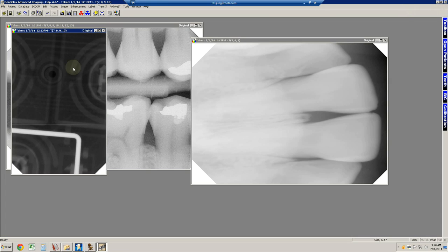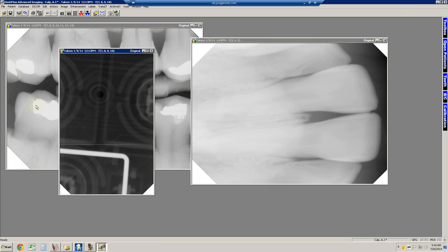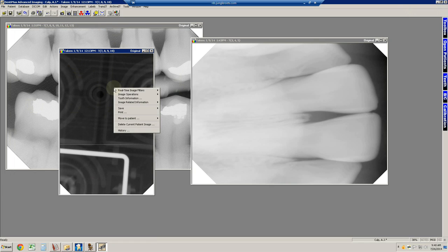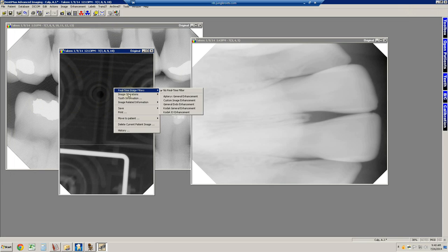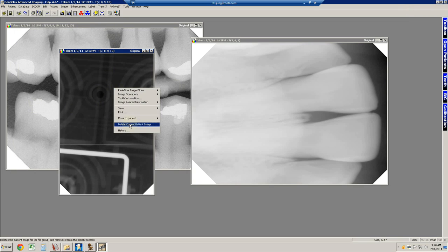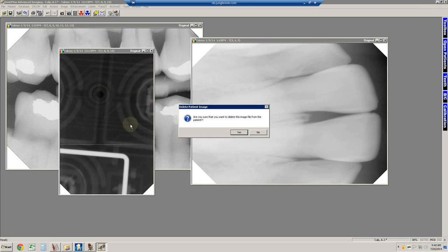Right mouse clicking again, you also have image operations. You can do some flipping if you need to. Sometimes the images are not acquired exactly the way they should be, and as a result, you might have to manipulate the image. The other thing in this particular case I'm going to do is delete this image. This is a singular image right here. It's not a grouping or a series of images. In this case, I just want to get rid of this image. I'm going to right mouse click, and then delete current patient image. Are you sure you want to delete this? Yes.